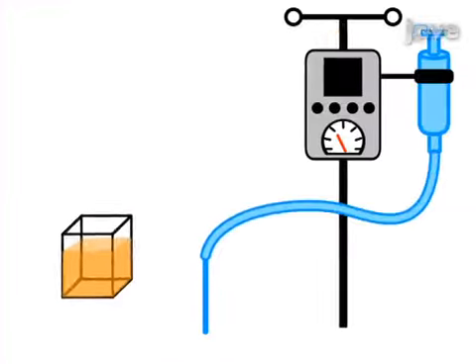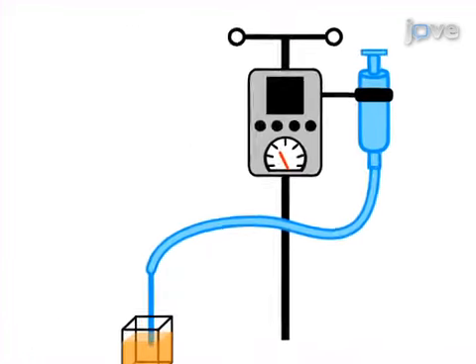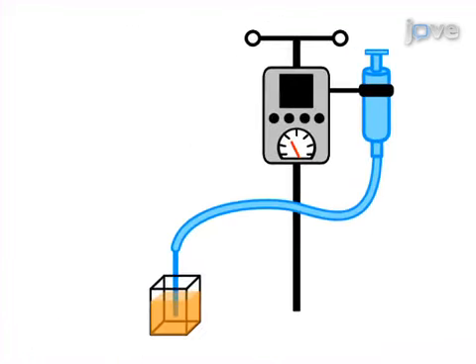The second step is to prepare the line and catheter for infusion, ensuring no air is present in the line to impair the infusion. The next step is to start the infusion, taking careful steps to prevent reflux and continuously monitoring the rate and infusate cloud via MRI.